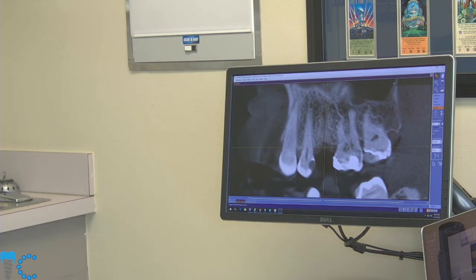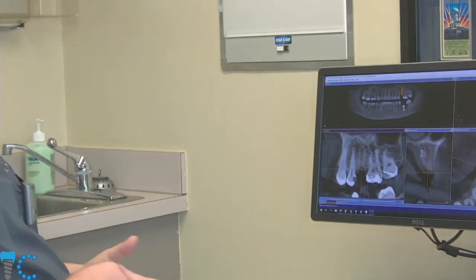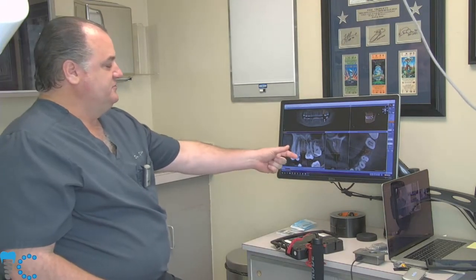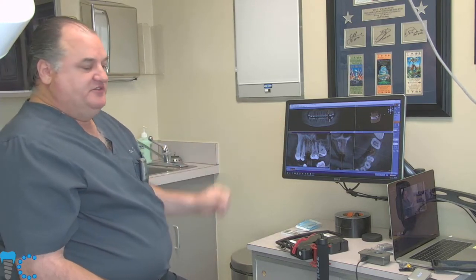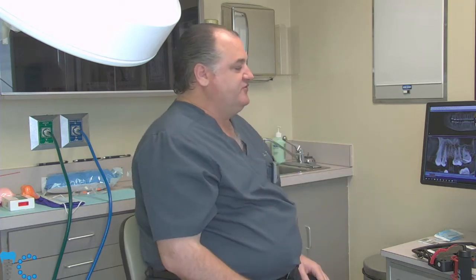At this point, we have the option of making a surgical guide, and we can make a surgical guide in one of two ways. We can make a simple one where we have a hard acrylic surgical guide, drill a hole through the surgical guide on a patient model, and transfer that to the mouth. When we do that, we typically just use that for the pilot drill so that we establish a proper positioning of our implant and a proper initial angulation, and then we do the rest of the drills without the surgical guide. So we use those surgical guides just for a starting point.